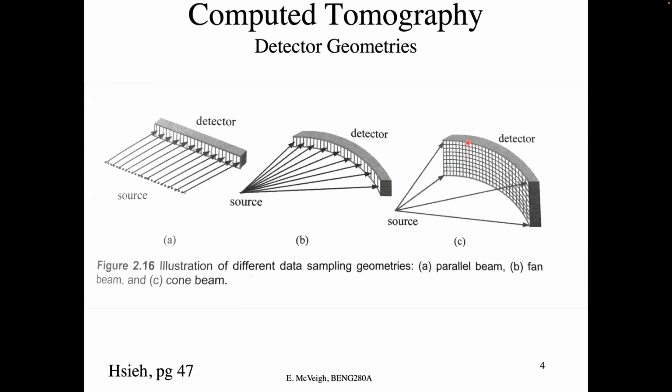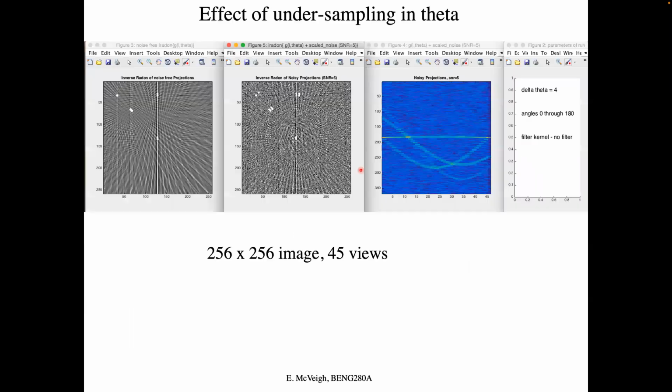It started out as 1, then went to 4, then 8, 16, 32, 64. And finally, one manufacturer made one with 320 in this direction. It's a little more complicated when your X-ray beams go off at angles in Z, but we're going to principally focus on the center of this detector, and we're down to 1D here.